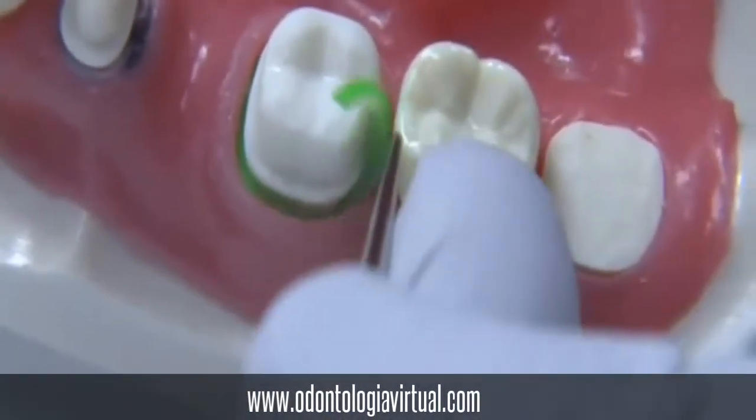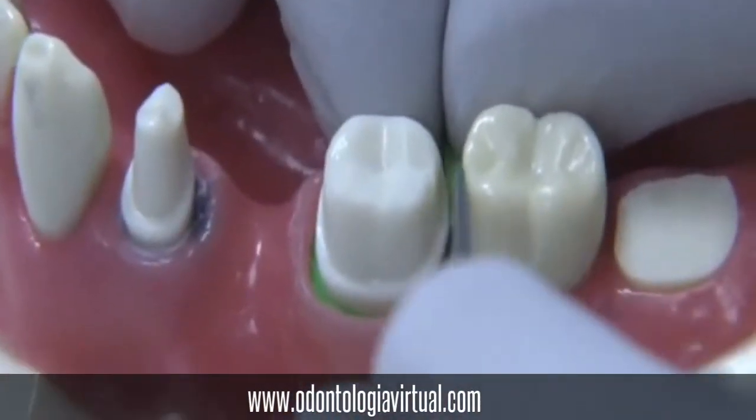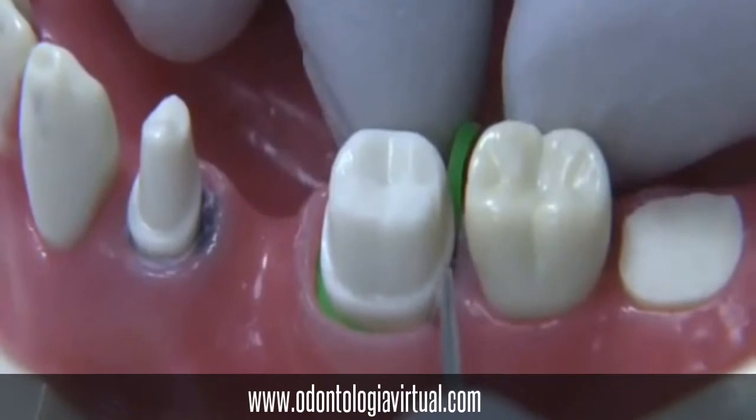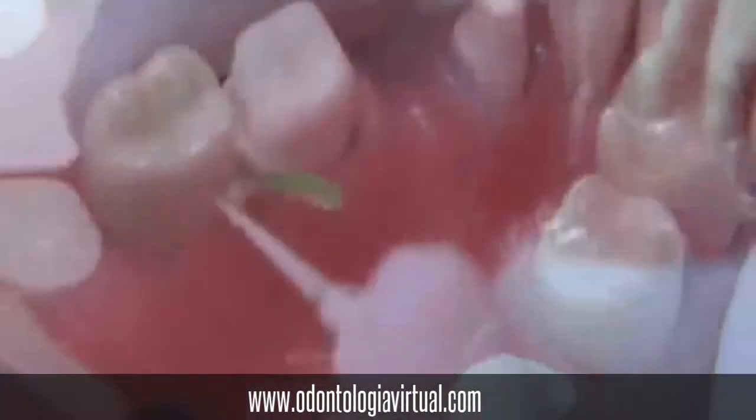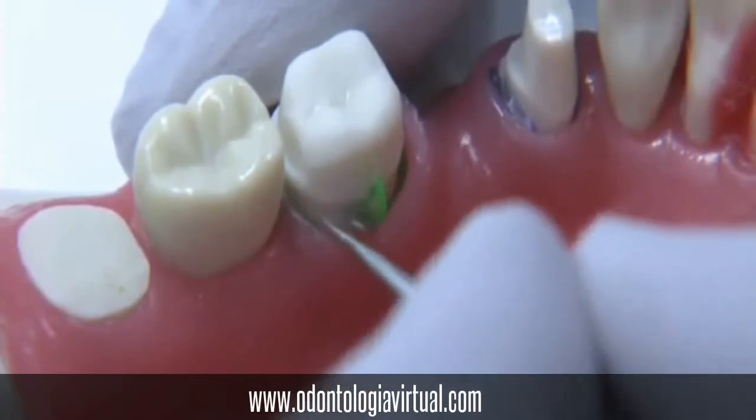As you go around, you have to push hard, and as you can see, we're going into the interproximal aspect, always making sure that our finish line is visible. This will make our impression much easier.